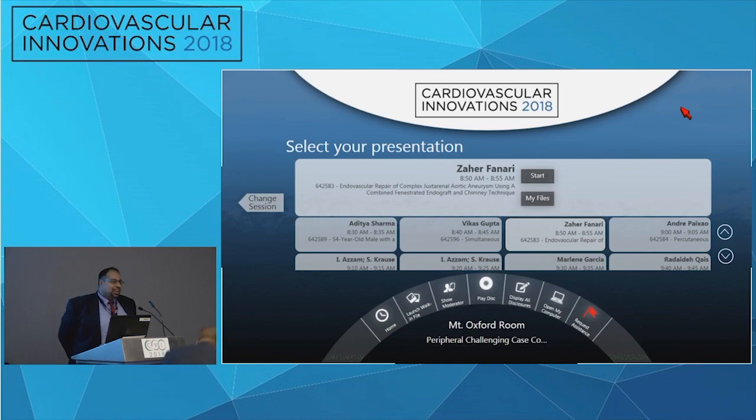This patient was placed on dual antiplatelets, and our plan was to keep the dual antiplatelets as long as we can. For follow-up, we're doing the CT, but we were always prepared, if the CT images were not good enough, to do arterial Doppler for the renal arteries and visceral Doppler versus angiography if needed. This patient is already 6 months out, and the CT showed very good flow in all. The good thing about the SMA is it's really big, so it's very easy. If you don't see it on the CT scan, you know it's not there. The renal arteries filled really well, but we were thinking about renal Doppler if we needed to.